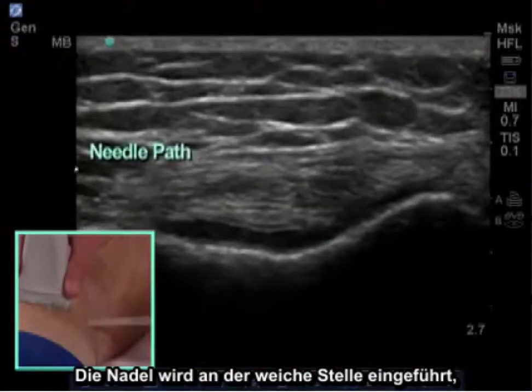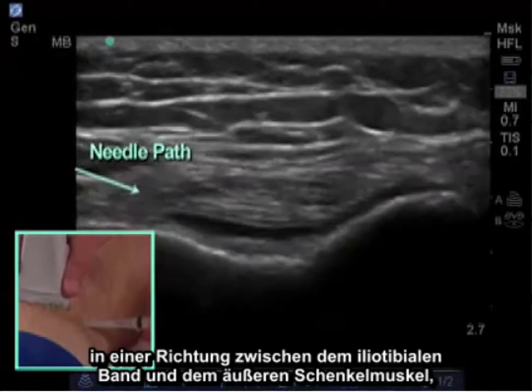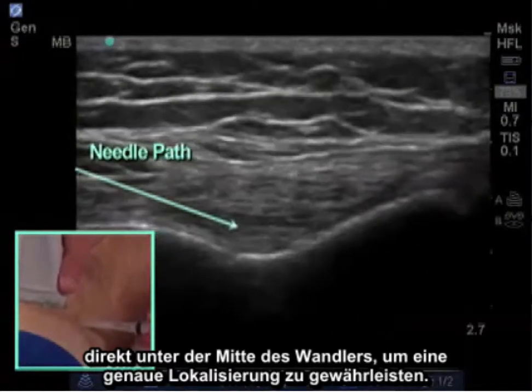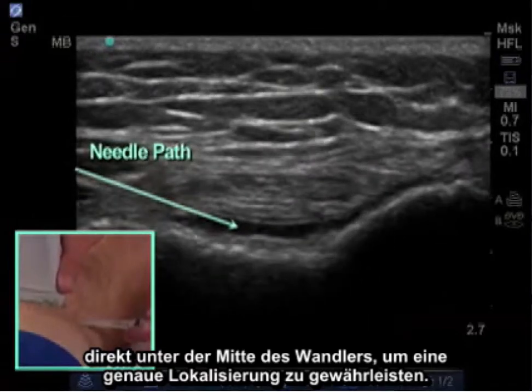A needle is inserted in this soft spot between the iliotibial band and the vastus lateralis, in a direction directly beneath the center of the transducer to ensure accurate localization.